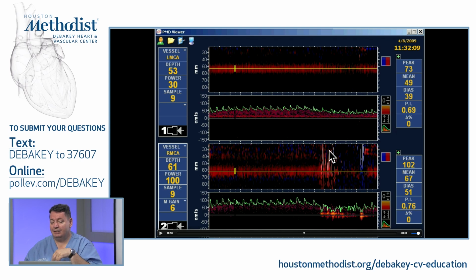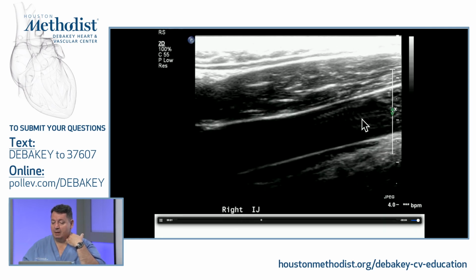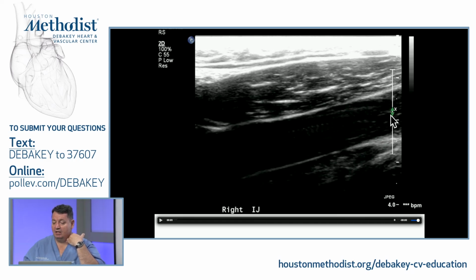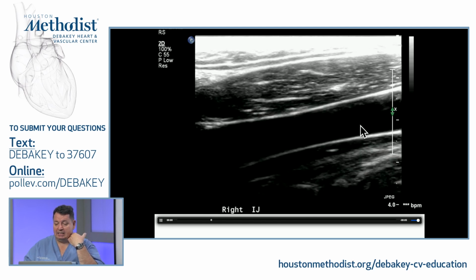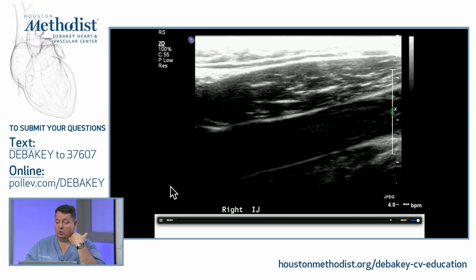If it's a true PFO, the heart as a central pump sends it to both sides. So you should see the bubbles on both sides. You see it unilaterally. And the confirmation was, we put the duplex on it, and we see the bubbles going towards the head. So the head is here, and during the Valsalva, you see the IJ letting the bubbles cross. I just think this is freaking amazing when you see those bubbles going towards the head.